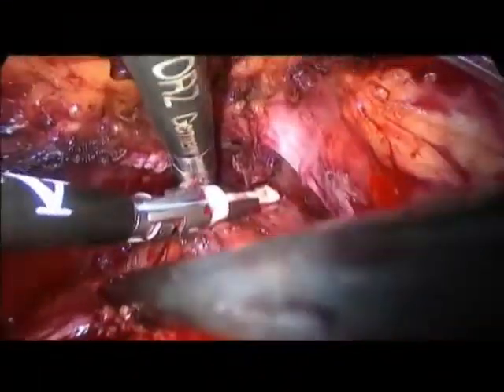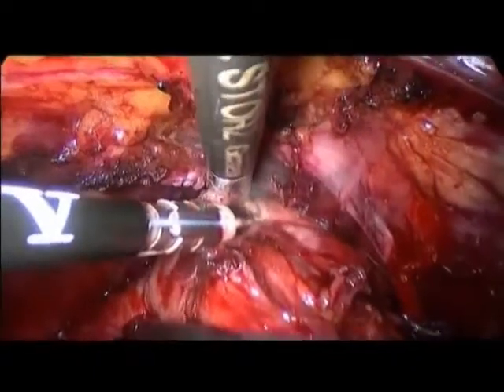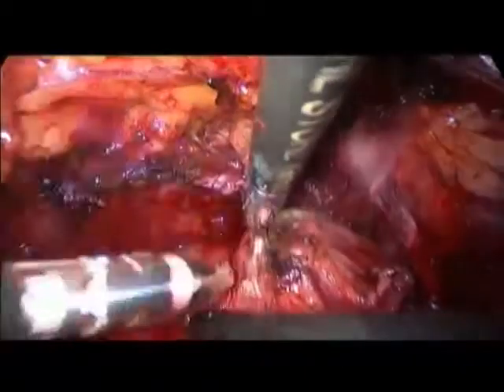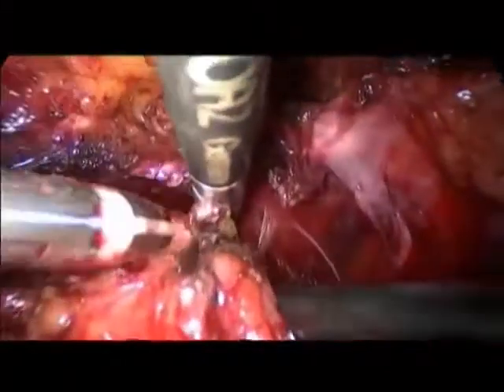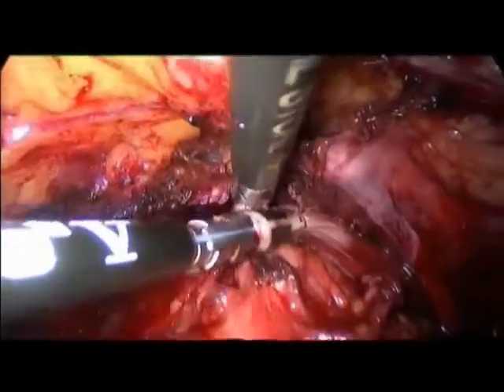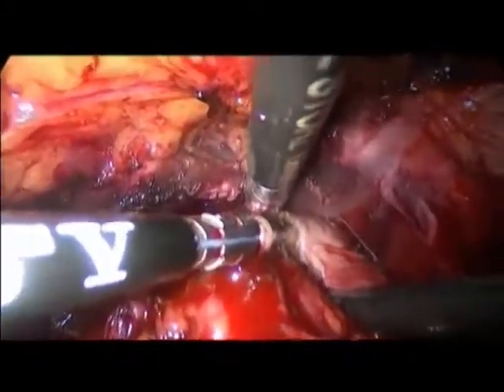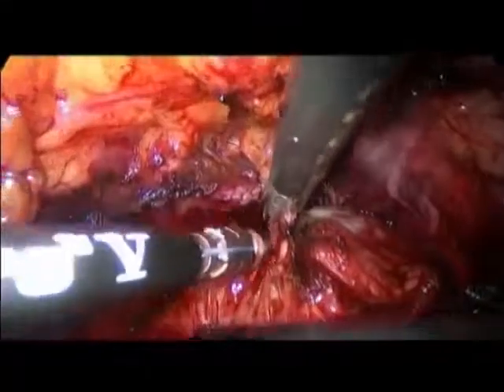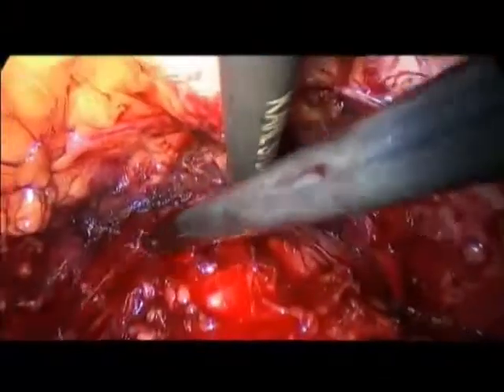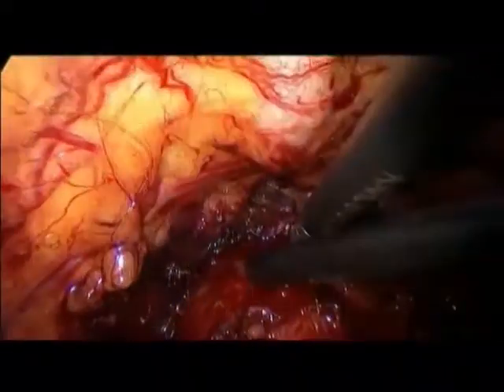So we can proceed towards the tip of the forceps like this. And we'll see how it's looking. Maybe one more catch. And after this, you will go to the bladder neck, I assume. Yes, after the stitch, of course. I'm not confident enough in this tool for dissection purpose, so I will go on with the scissors. I need to throw this one. No, I have them.